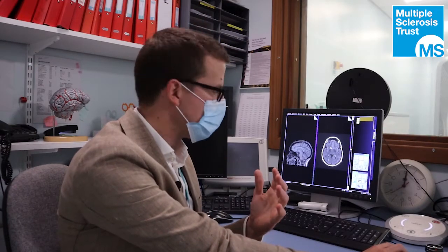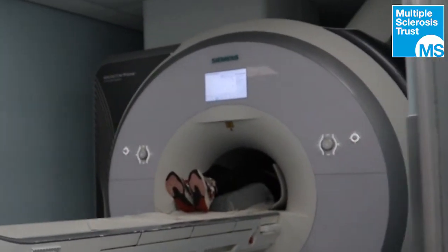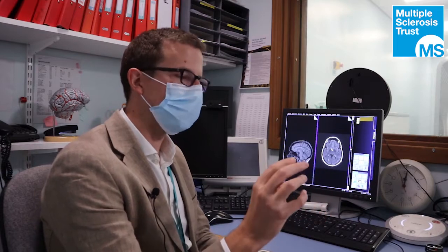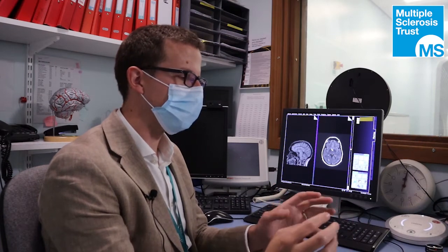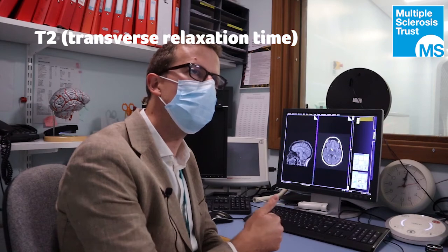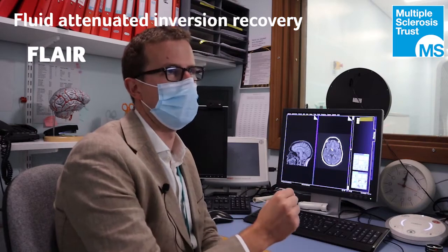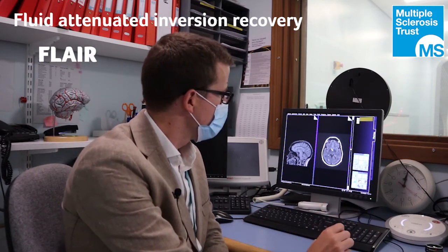When you're in a scanner there'll be noise for a few minutes and then a gap, noise and a gap — those are different sequences being collected. The MRI settings are changing so you're getting at a particular thing. Each sequence is good at picking up specific abnormalities. For MS we're particularly interested in three: one is called a T2, another is called a FLAIR, and those are the ones for detecting lesions on scans.